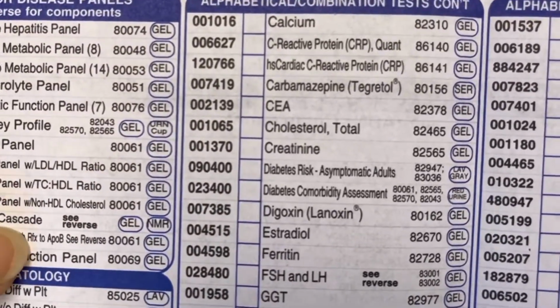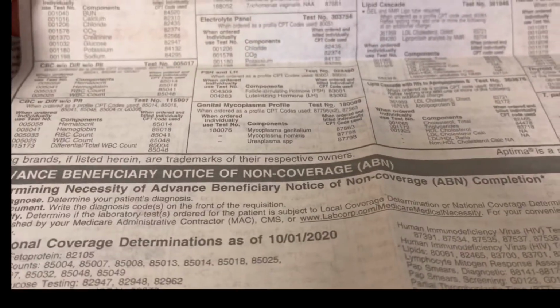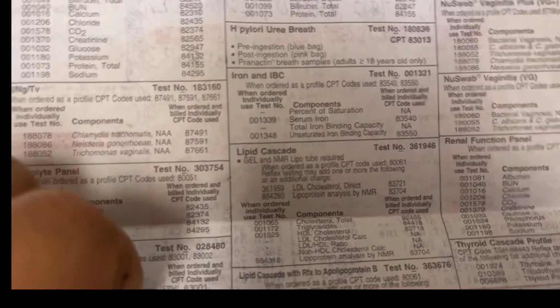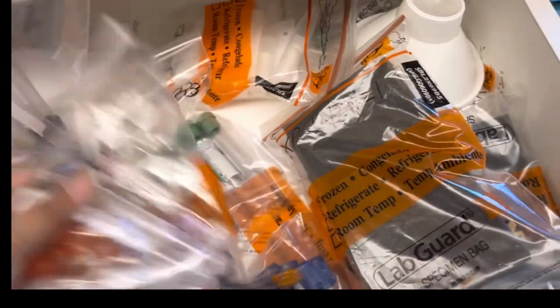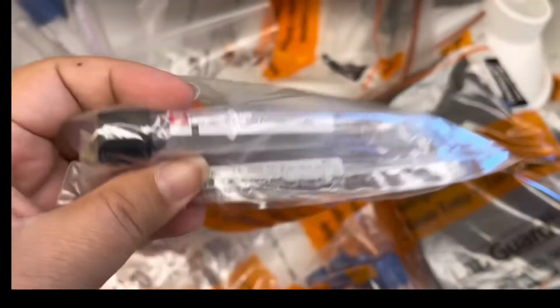This one is a special test right here, lipid cascade. It says C reverse. So let's see. Lipid cascade. Let's see. See, here's more information about that test. It goes in a gel and NMR lipo tube. So I'm gonna show you guys what NMR lipo tube looks like. NMR lipo tube looks like this. There you go. It has a gel separator.